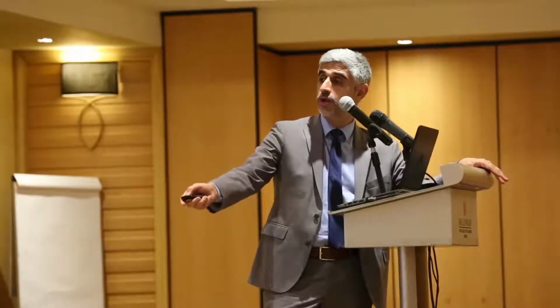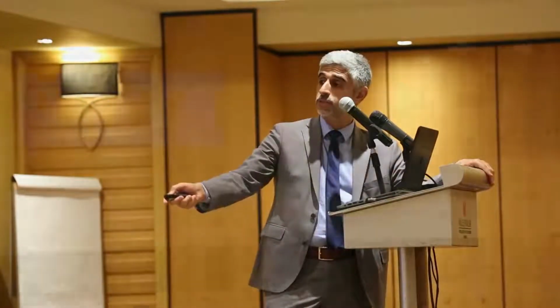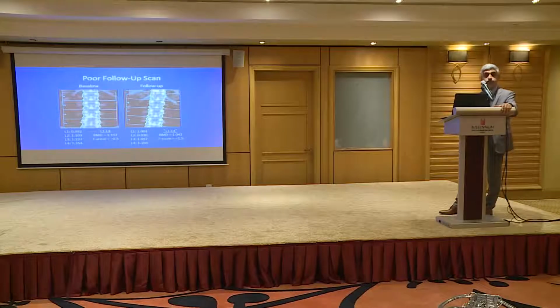This is the initial baseline scan, very similar to what we described. Floating rib is there, iliac crest on the sides, L1 to L4, good edges, good labeling. Even the lines between the intervertebral areas are done correctly. But what's wrong here? So what's wrong with the position? Tilted?